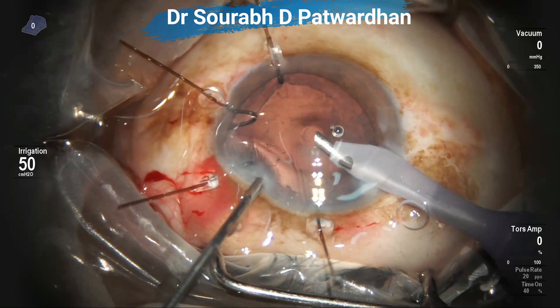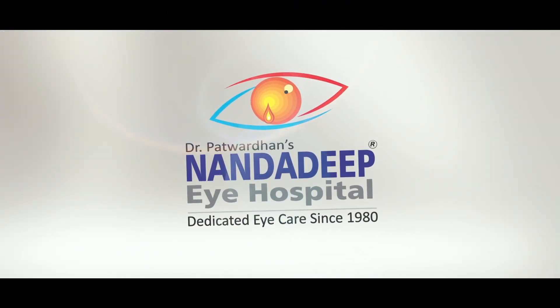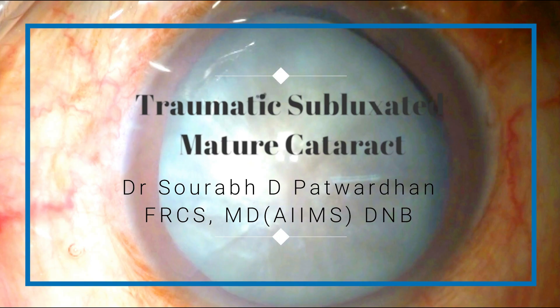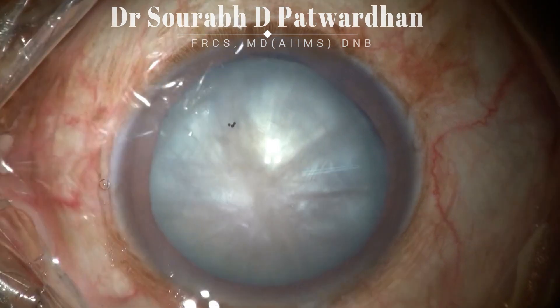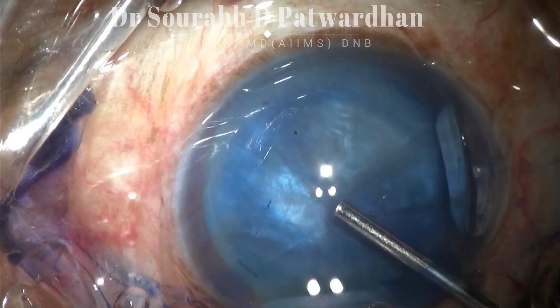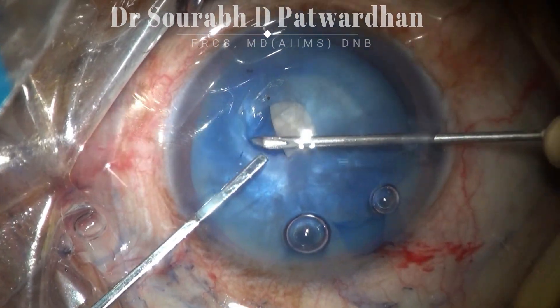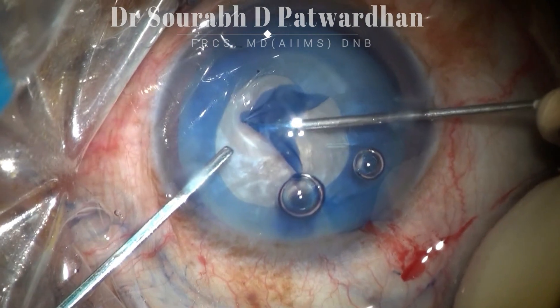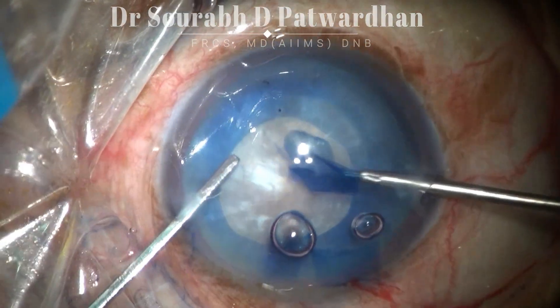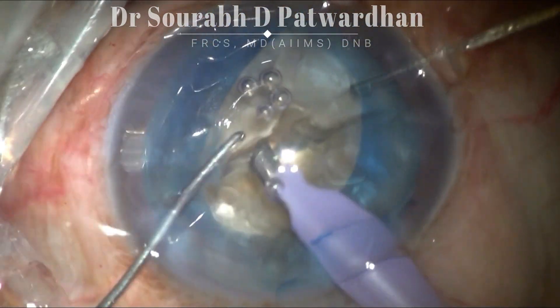Always use low parameters for doing faco. This particular habit you should have: insert OVD from the small side port using your non-dominant hand so that the anterior chamber remains inflated when you are taking out your faco probe. This is a hard subluxated cataract. Once you support the subluxated area well with the capsular hooks, you can tackle any grade of cataract — that doesn't matter. You can use standard nucleotomy techniques. The chops will be better because you are not pushing the bag down. Even if you are doing a sculpt and divide maneuver, make sure you are not pushing the bag down.